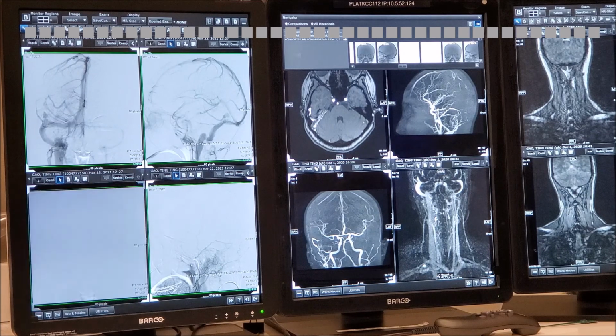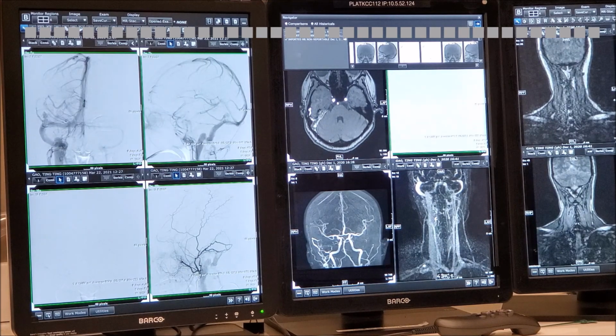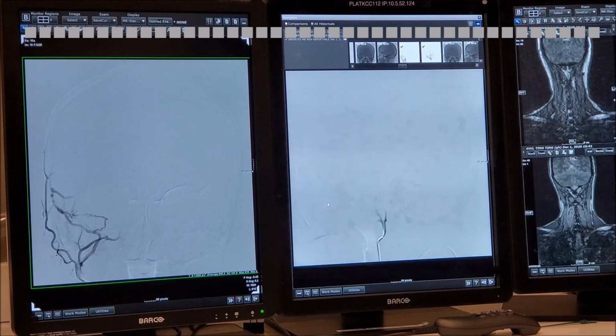So let's see what we did next. Okay, a better center, and better instruction to the patient. Very good. Okay, so let's analyze. We're going to put this one here, and we're going to put this one. I like this picture here. Okay, so we're going to make it a little bit bigger.